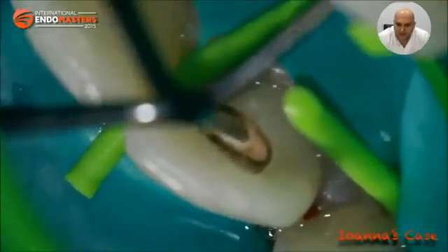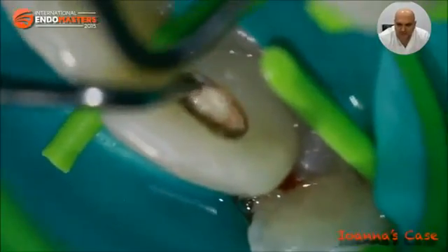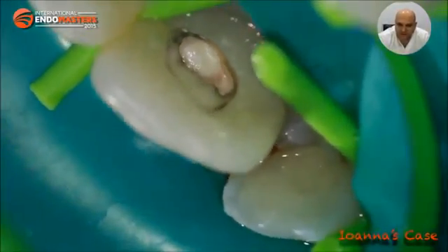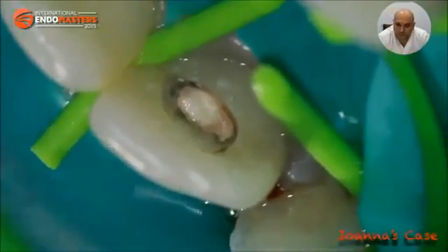The black line around the MTA that you can see under the microscope, it's not leakage, it's staining. Yes, the white MTA stains the tooth structure. Bismuth oxide reacts with collagen and gives you a grayish discoloration. In the case of Joanna, staining was removed with the diamond burr. Actually, it was drilled out, and a composite resin restoration was achieved.